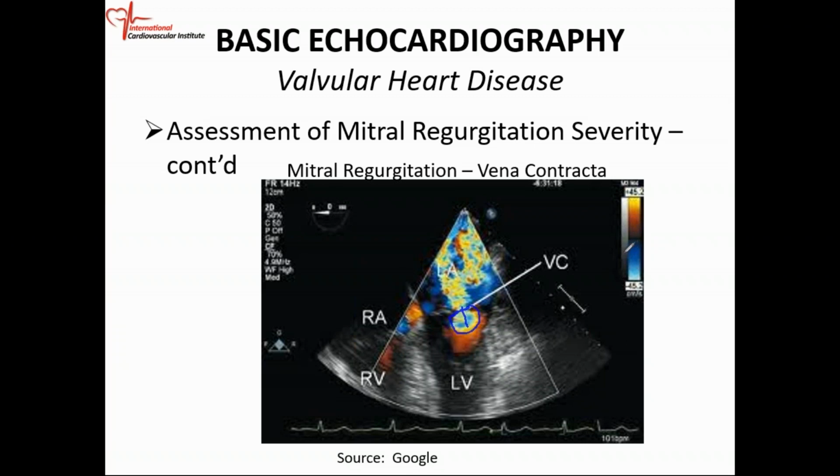We call it a baseline shift. So you can adjust the aliasing velocity to get a nice hemisphere. Even if you start out by not getting a nice hemisphere, once you do your baseline shift, you can get a nice hemisphere. And again, this would be the radius.